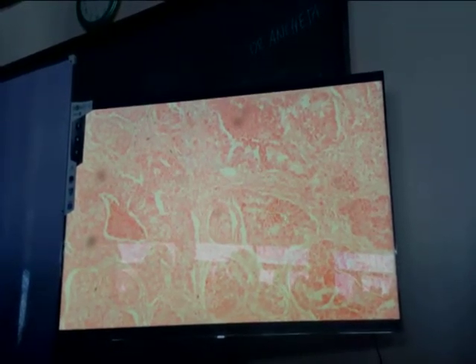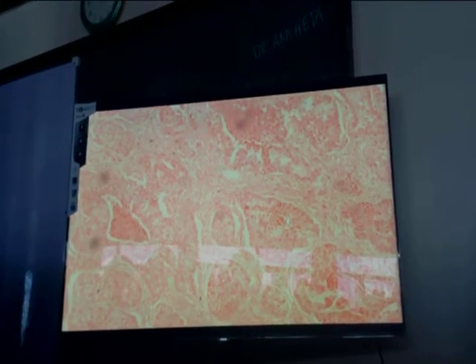Okay, so that is also another irregularly shaped gland with marked stratification of the tumor cells lining the gland. Now, adenocarcinomas most of the time will have firm or hard consistency because of this response of the stroma or the connective tissue. How do you call this fibrous response? Desmoplasia. Very good. Of the stroma in the presence of the tumor cells. So you will be able to see same type of histology in any organ that will develop adenocarcinoma. Because adenocarcinoma is a malignancy composed of glands lined by tumor cells. So you will be able to see this type of morphology in adenocarcinoma of the uterus, adenocarcinoma of the large intestine, or anywhere in the body.